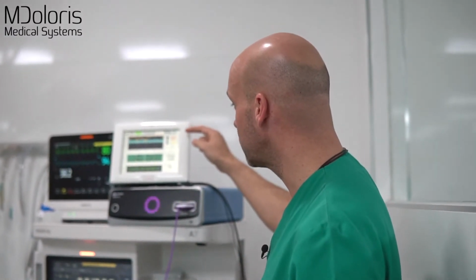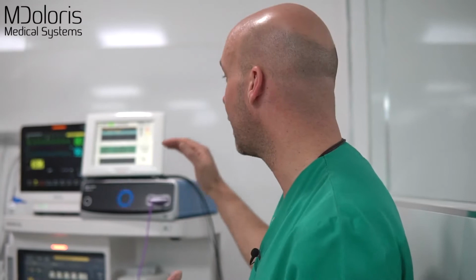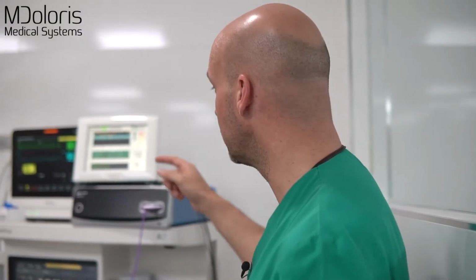We are going to have as well another number, which is the energy value. The energy value is going to tell you the total power of your autonomous nervous system. In a healthy animal, we will have a number around 0.8, 1.2. When I put anesthesia on the animal or in the person, we will see that decrease because of the activity of the anesthetic drugs, and it will go to 0.3, 0.4, 0.5. Those are numbers in healthy beings.